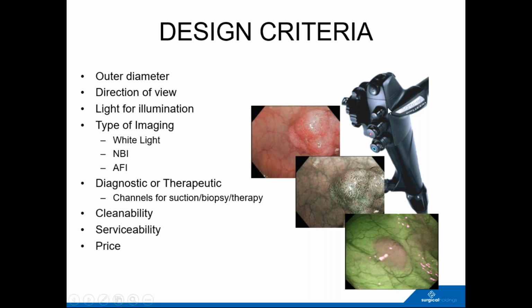As you can imagine, these are high-tech optomechanical instruments, which really are state of the art. I mean, they take around about a month to make, and so they're expensive. A state-of-the-art colonoscope, you could get a very nice car for the price of a state-of-the-art colonoscope.